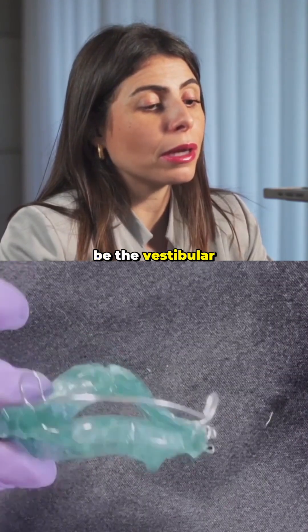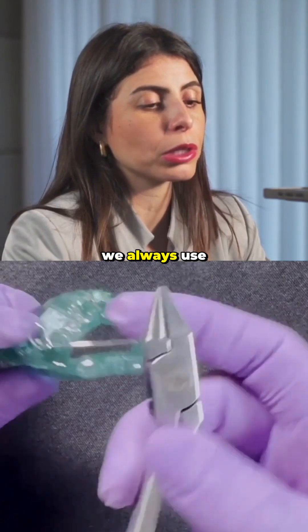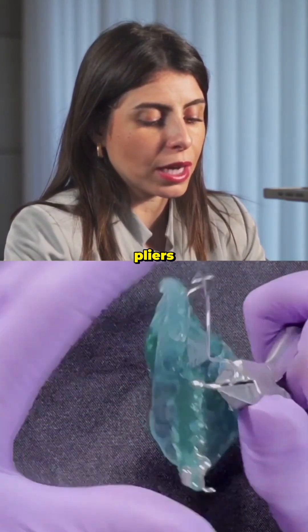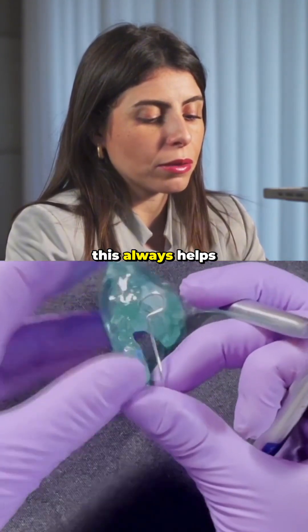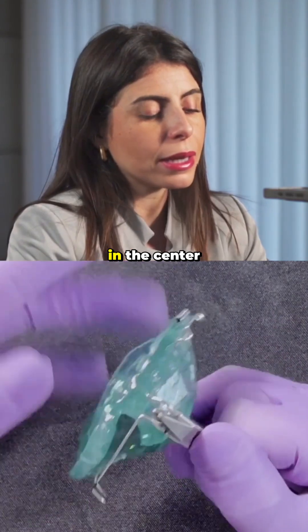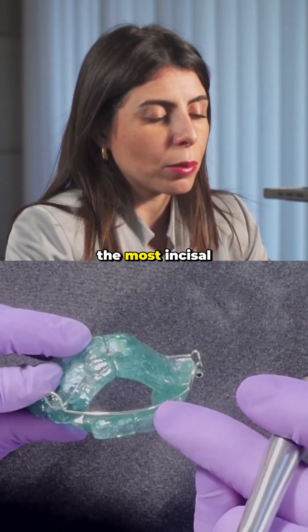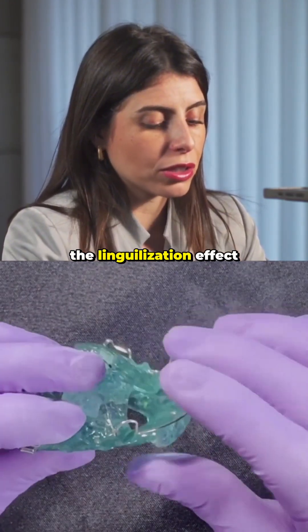Another point is the vestibular arch. To activate this vestibular arch, we always use our bird beak pliers. We place the rounded part of the bird beak pliers on the inside of the loop and close the loop. This always helps us centralize the vestibular arch in the center of the incisors, or we can also place it at the most incisal part of the upper incisors to help create a lingualization effect.